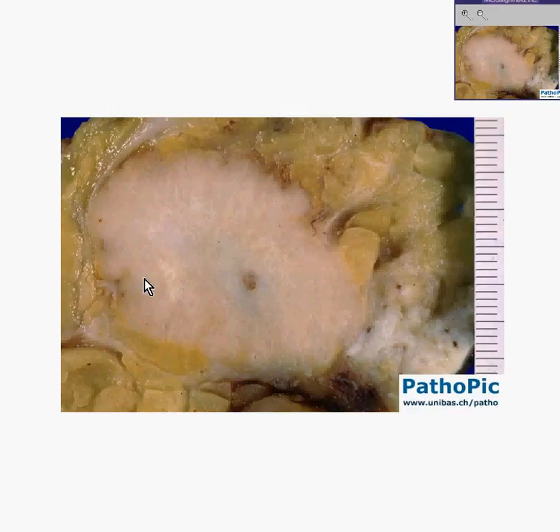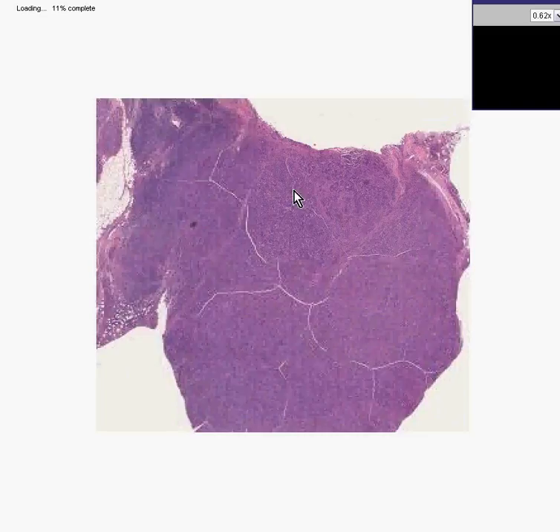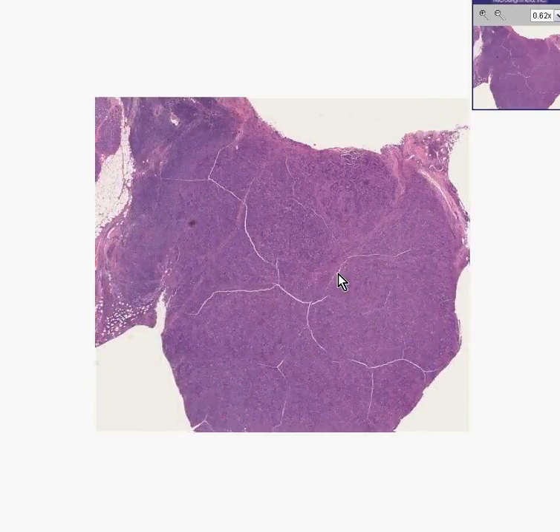And microscopically, when you look at this tumor, it looks very blue. You are thinking, gee, maybe this isn't a breast tumor at all. Maybe it's a lymph node. Notice how the interface between the tumor and the fat is pretty sharp here, and perhaps not as sharp over here. So once again, you're wondering what's going on.